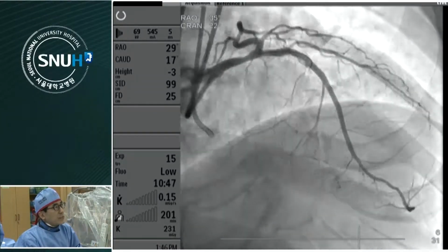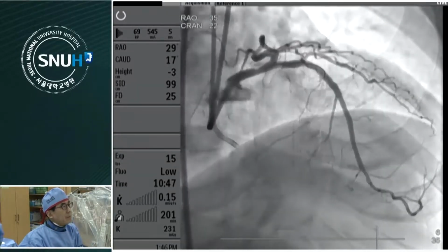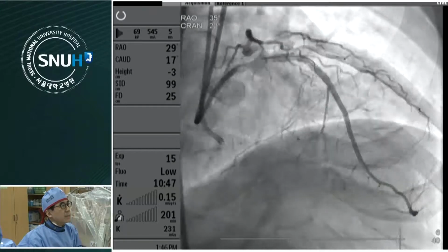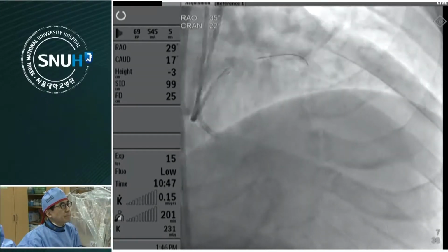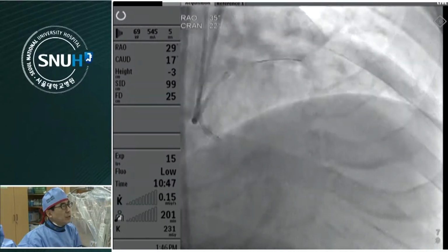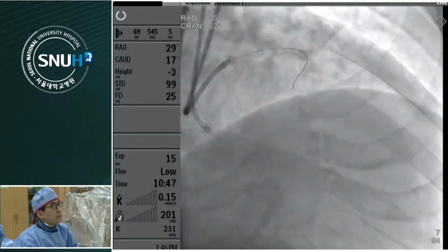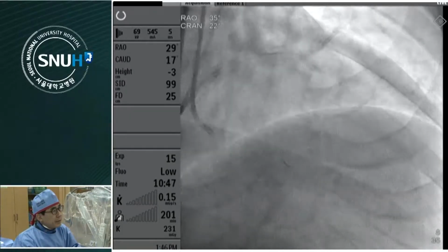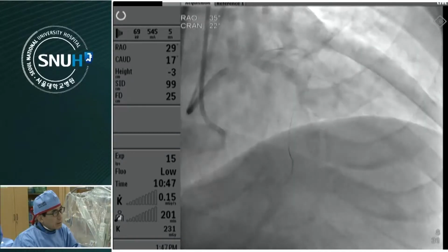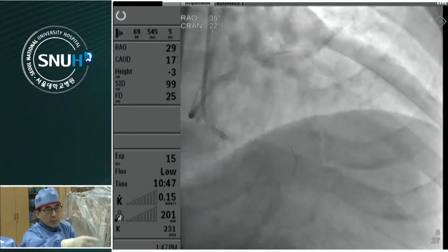I first try to select the first septal retrograde approach, but it is from the stented segment. It's not so easy to engage the wire. With various kinds of maneuvers, I put the wire into the first septal, like this, plus an advanced wire into the far distal, as shown here. The route is acceptable, as we can see in the reference image.